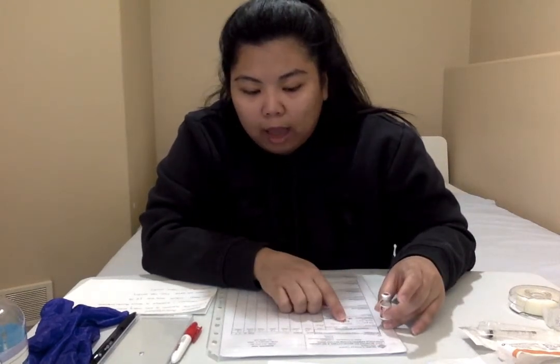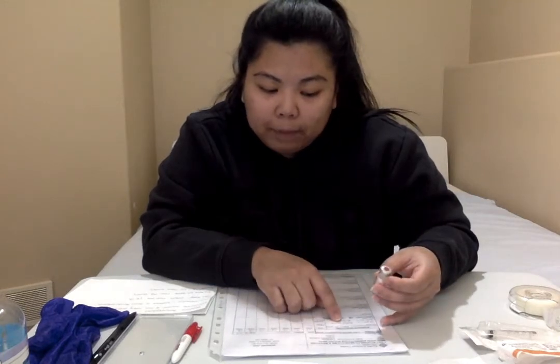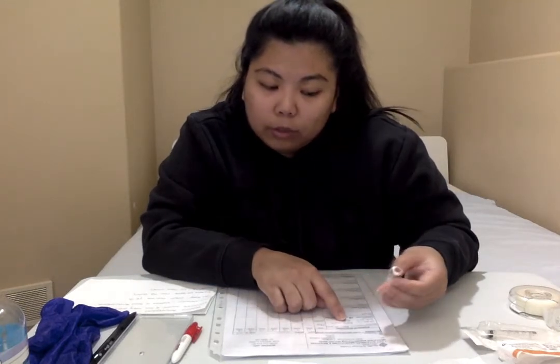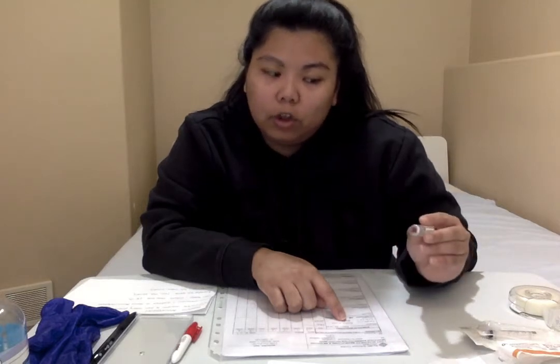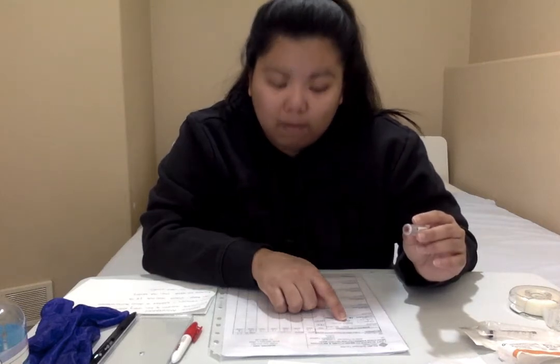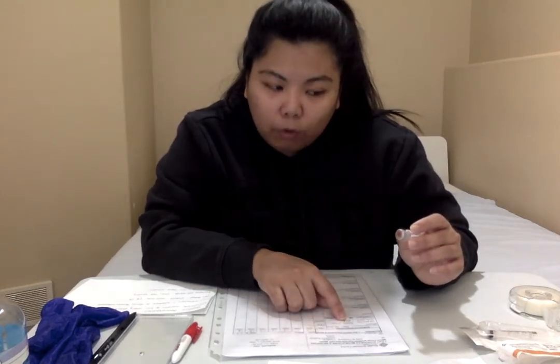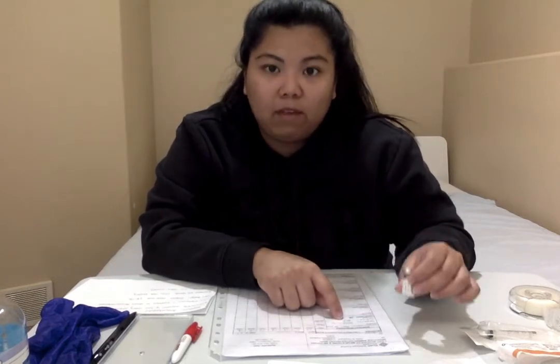To get the volume of medication that we need, we would look at the dose that is required, so 5,000 units, and then we look at the concentration of the drug. So it says on here 5,000 units per 0.5 ml. So the volume that we need for this drug to get 5,000 units is 0.5 ml.